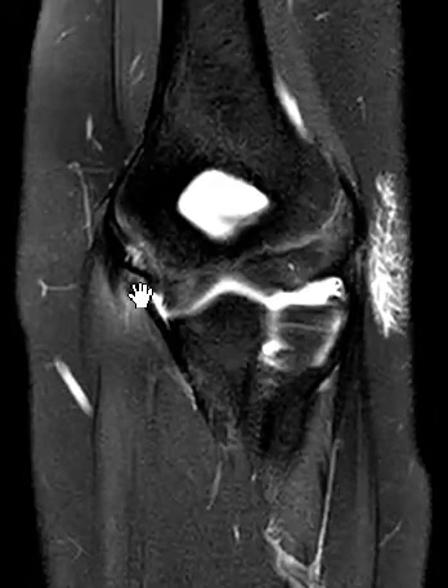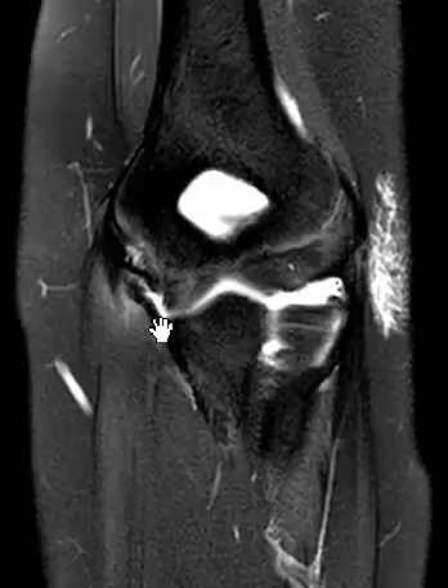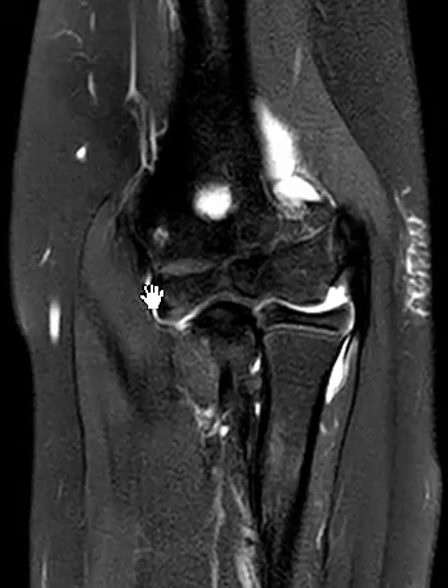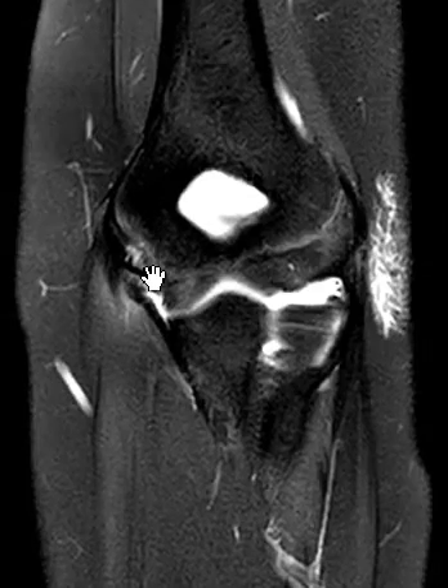It's maybe distracted ever so slightly — it's not completely torn off, but it's a partial tear of the UCL. And then for the anterior band, you usually go one cut forward like this. We see a linear band coming here, but the anterior band — I just don't see that in him. So it may be partially torn or attenuated. Maybe I just can't see it.